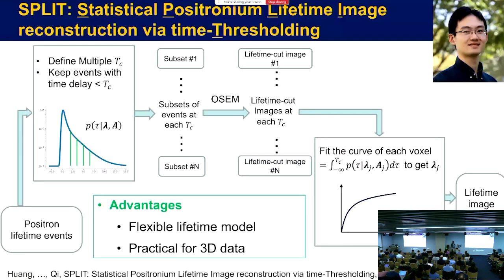Well, in fact, you can see there's a lot of similarity between the lifetime reconstruction in this framework and the frame-based dynamic PET reconstruction. Okay, but it took us a little time to reach that aha moment, to realize we can actually solve this fairly simply once we make that analogy. But the initial development was not obvious.